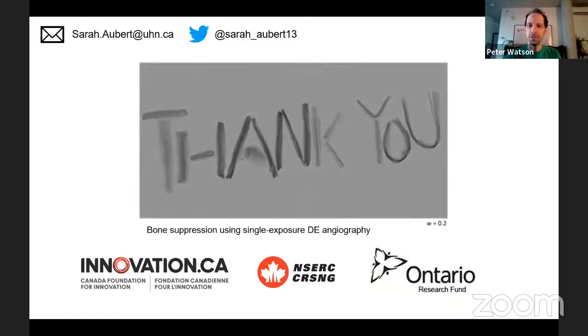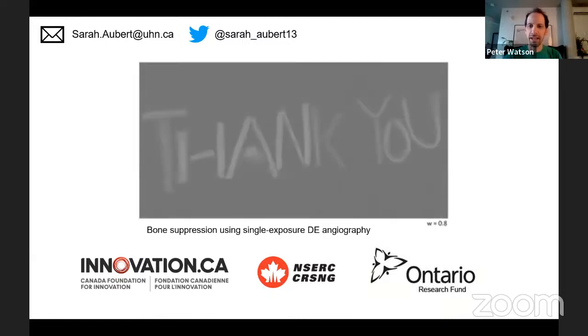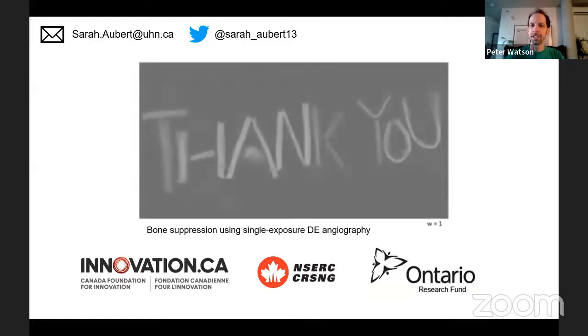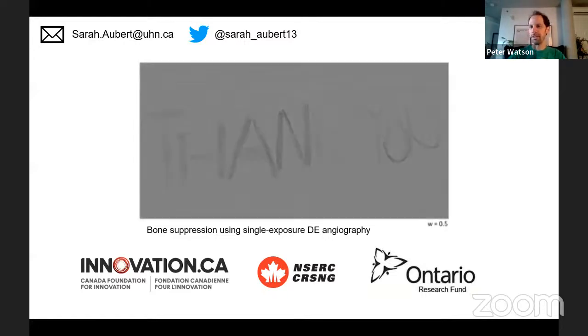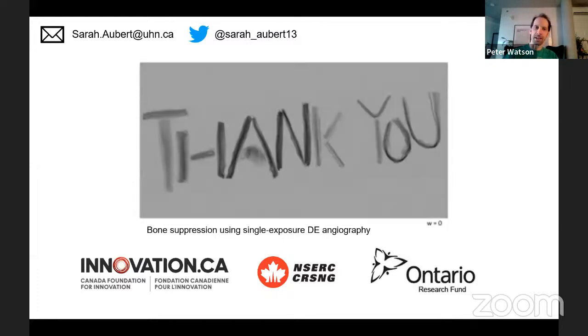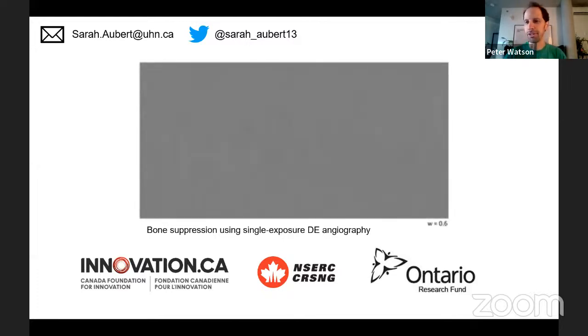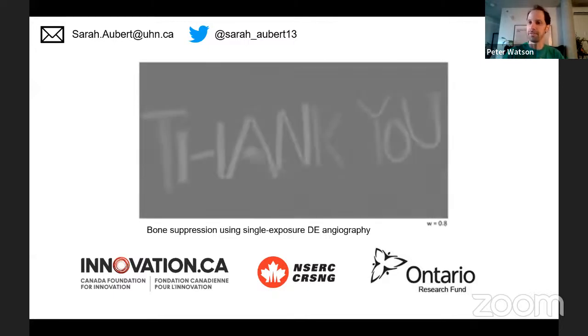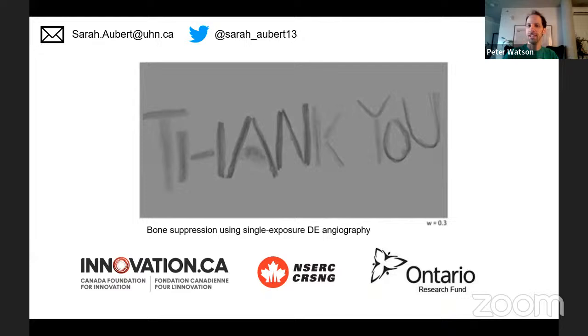My first question, this was super interesting. You made a point that everything you studied so far was with your experimental photon counting setup, and that in practice, the clinically available angiography systems all use energy integrating detectors.